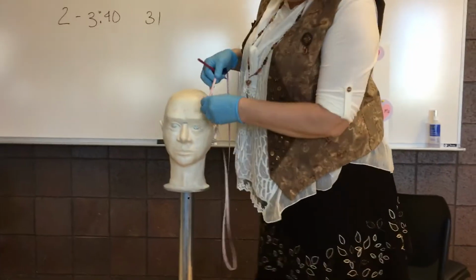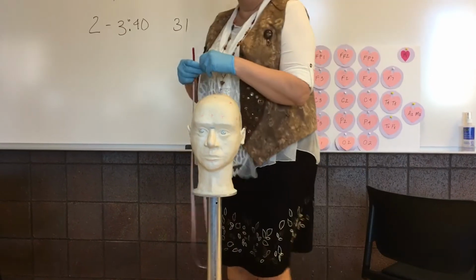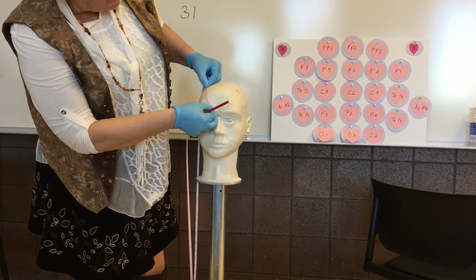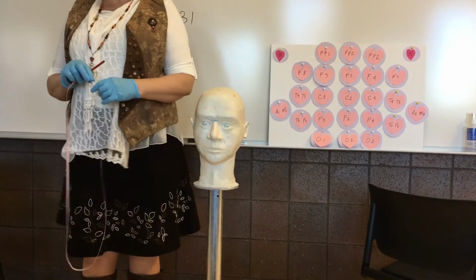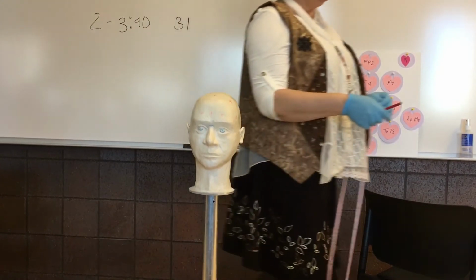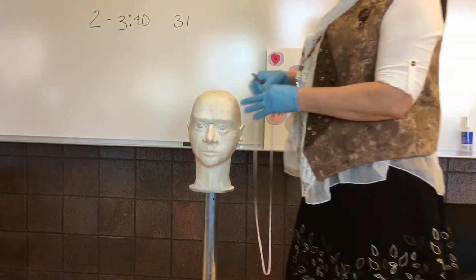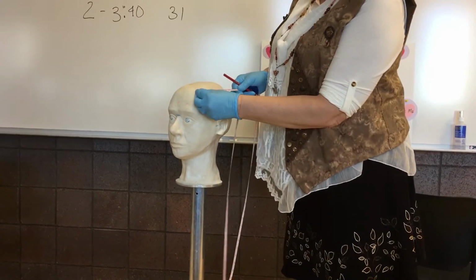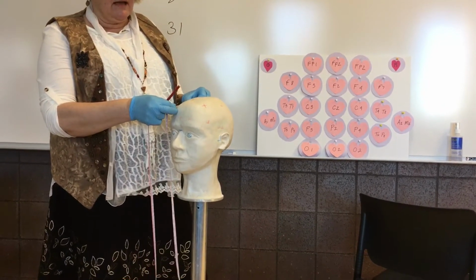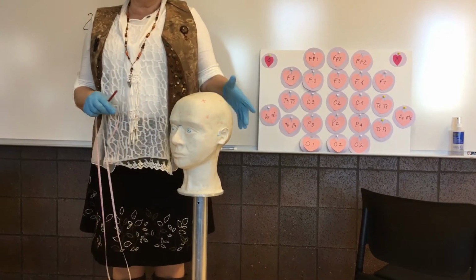So if I measure from FP1 to F3, I get 6.6. So now I'm going to measure FP2 to F4, and what do I get? I get 6.6. Is there a deviance? Can you have 1 millimeter difference? 2, 3, 4, 5 millimeter difference? Up to 5. Okay? Same thing if you measured F3 to C3 and you get 7, F4 to C4, and you get 7.1. Is that deviance okay? Okay, does that make sense?